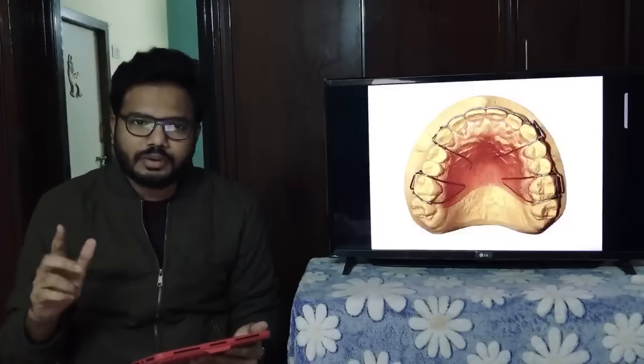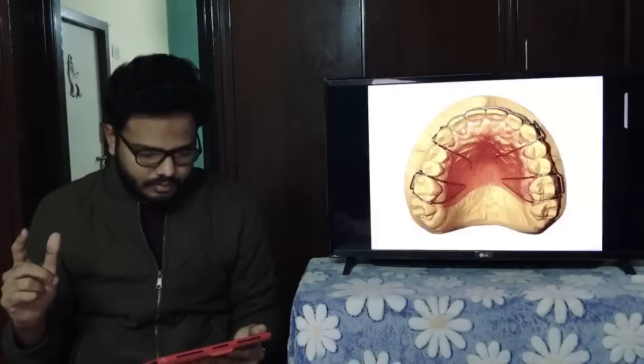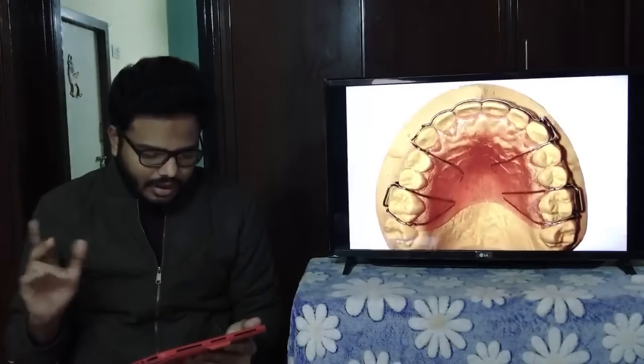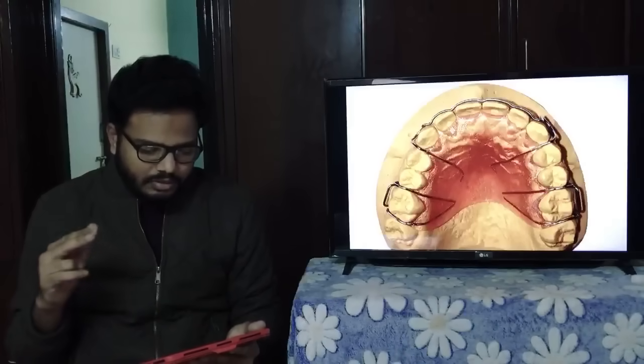if you want me to zoom in, I can. Identify the appliance. So you can see an acrylic plate, Adam's clasp on molars, and there seems to be some labial bow.